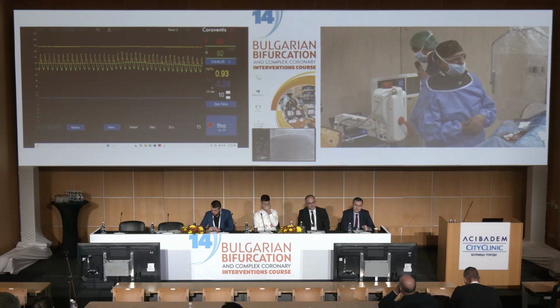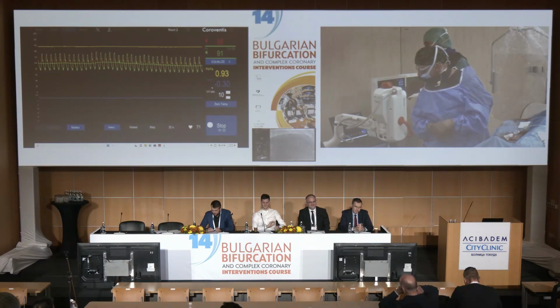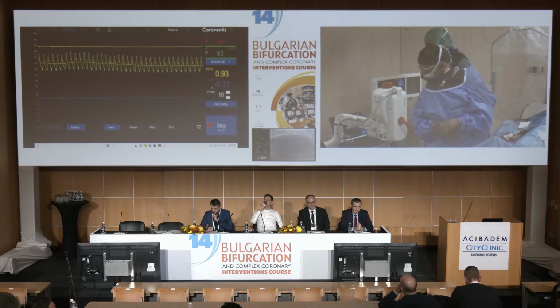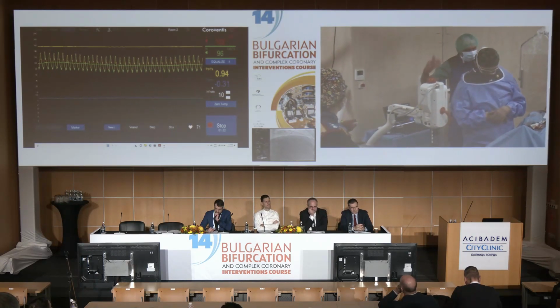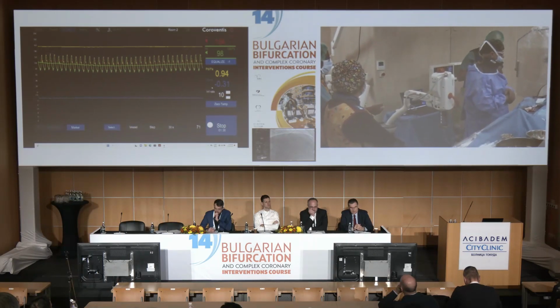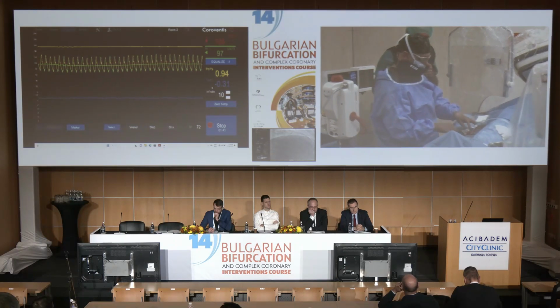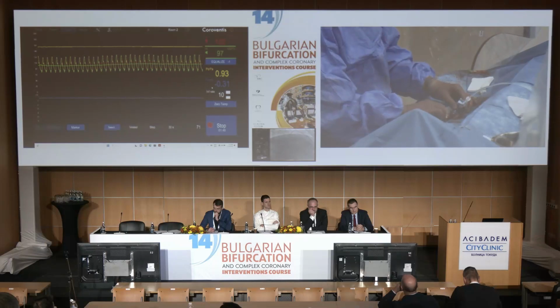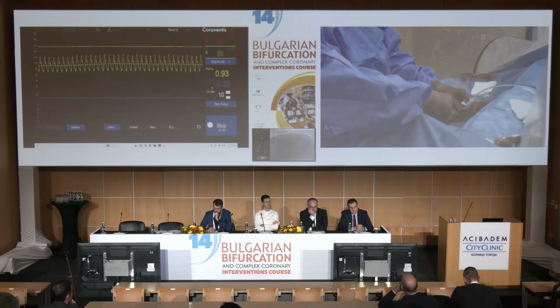I see the nurse understanding very well what I say, so thank you very much. So we are at rest. And now it's really stable. We are minus 0.3. That's what we are used to. Tabo will continue infusing, and I will ask Valérie, I did not warn you, but Valérie, you are going to keep your foot on the scopy and pull back relatively fast. No, not the catheter, but the wire, the sensor. Keep the catheter in your hand so that the catheter will not move.